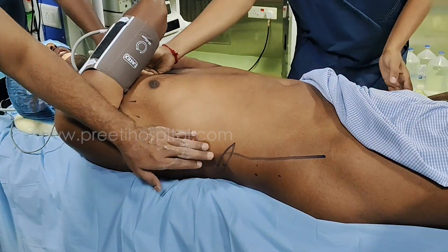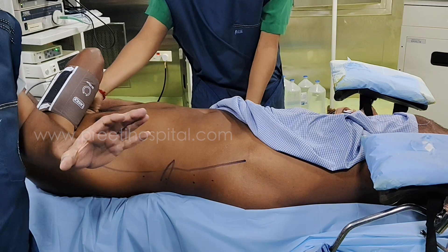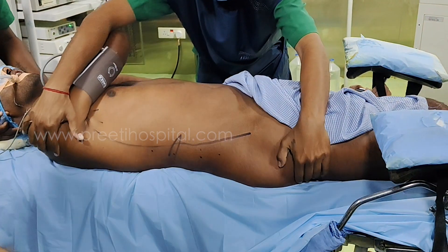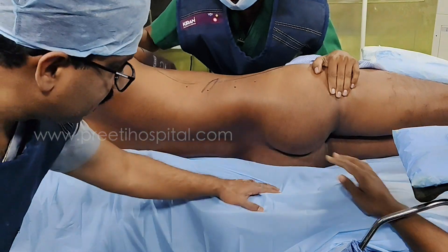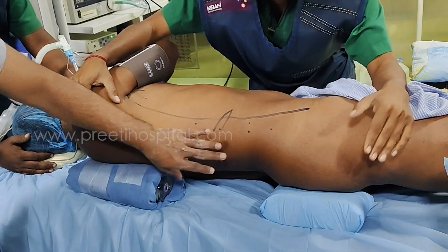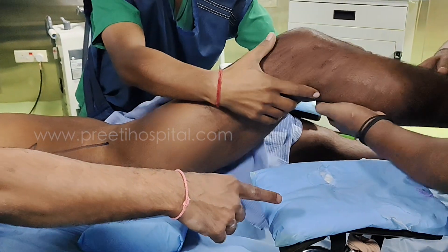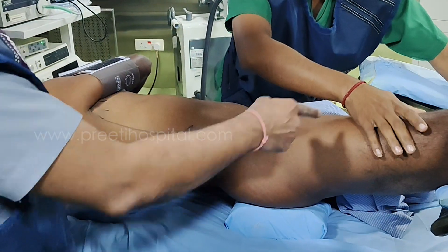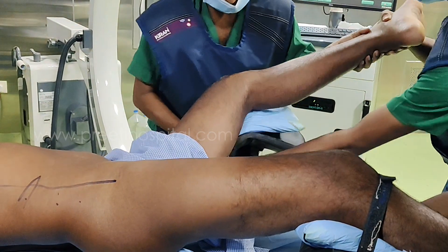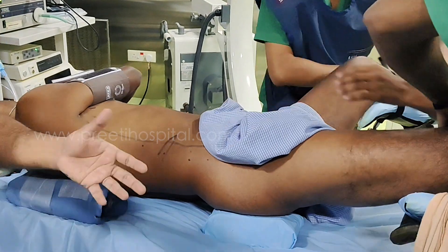Coming to the position: this basic supine position will work, but for more comfort, you need a slight tilt. Turn 15 degrees. One person turns the patient, places a support below, and drops it. The entire position is set — like a plank. How much time did that take? Ten seconds. One person, ten seconds — position ready.